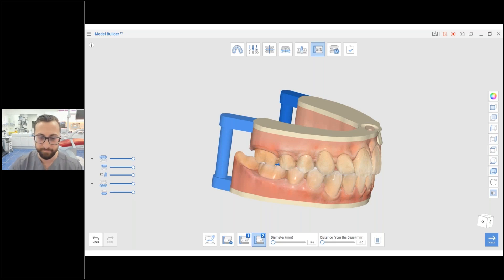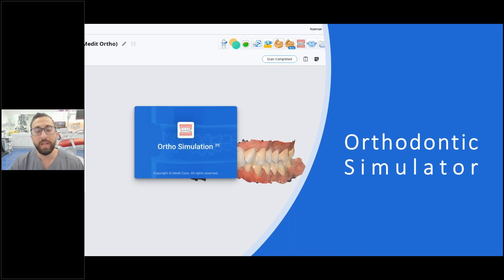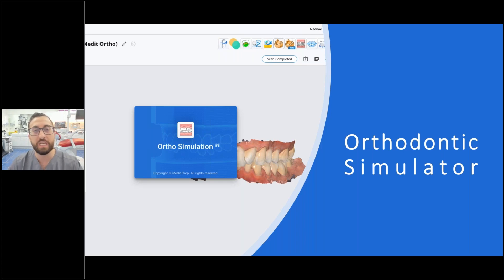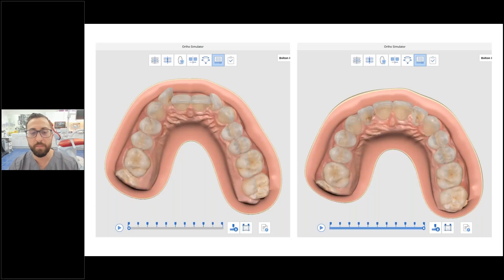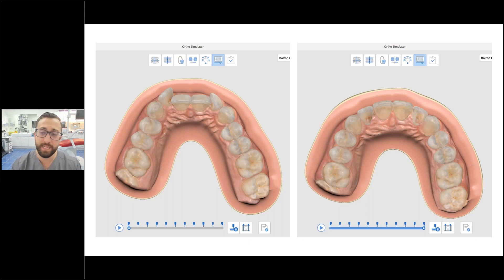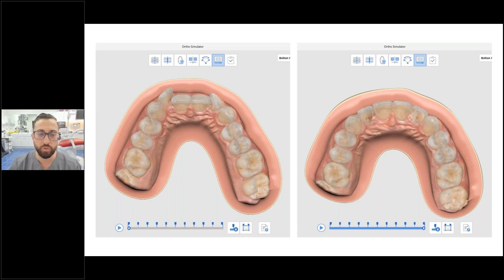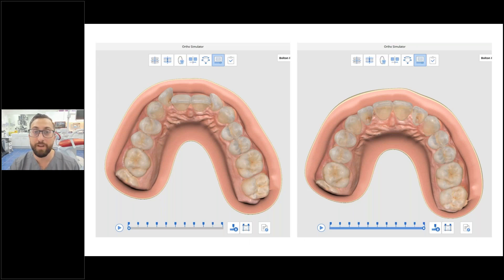One common misconception about orthodontic simulators is that they are not orthodontic treatment planning tools — they are simply a communication tool. You scan the patient and with a few clicks show them an example of what could be possible with orthodontic treatment. This is not a treatment planning tool like Invisalign ClinCheck. And all these Medit apps are free for anyone — even if you have a 3Shape scanner, you can use Medit Model Builder.